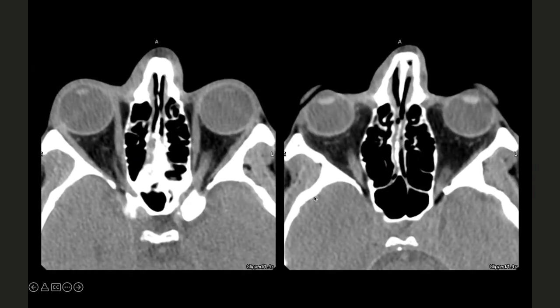So this is what kind of study? CT or an MR? CT. Perfect. I have taken this at two different cuts. One here is the lens, right? I do hope you can see the arrow because I was told you can. So the lens, look at the density. It is not exactly like bone, but it is dense. It is dense with respect to the fluid.